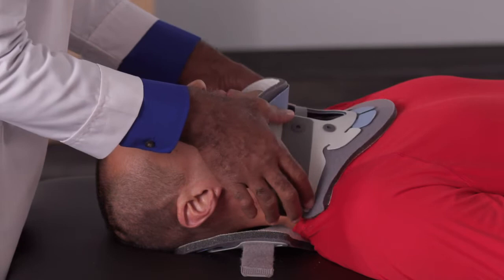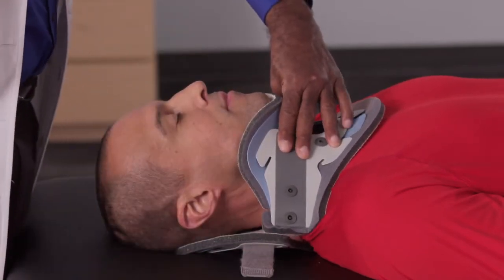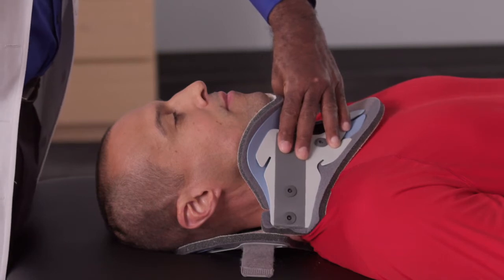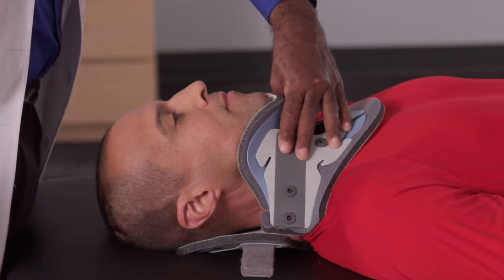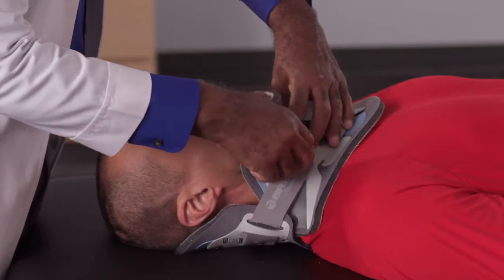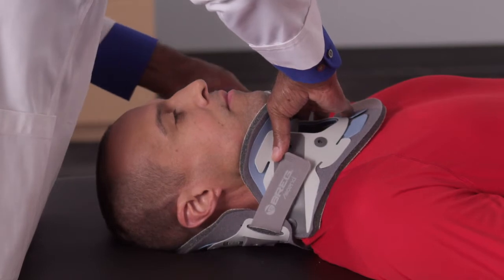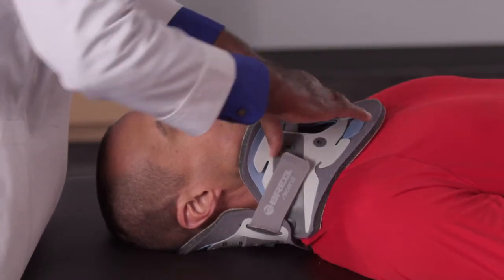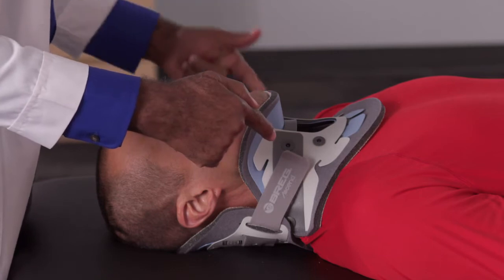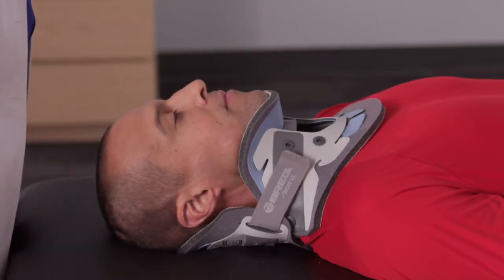Apply the anterior panel under the patient's chin. This is a good time to check and ensure that the height of the collar is ideally positioned to achieve a neutral neck position after the fitting. Once the anterior panel is positioned, wrap the posterior straps around and engage the hook on the anterior panel. Ideally, you want the straps to end equidistant to each other. Remember, you can modify the tension as needed based on patient anatomy.